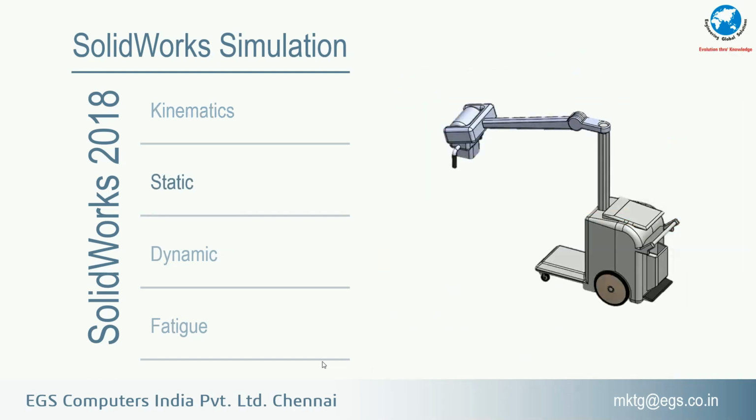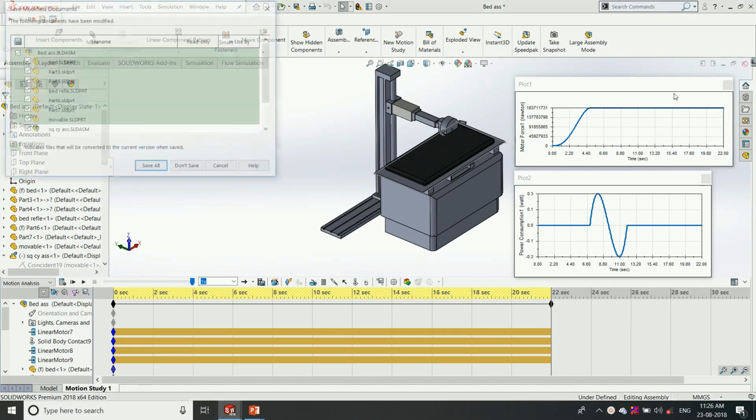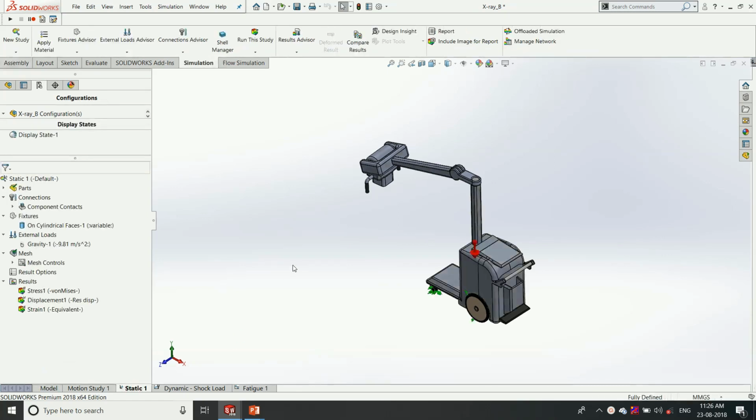Now we are going to study the static analysis. In static analysis we are going to study what the stress level or the stress distribution in the area is for the given load, so that we can find whether it will satisfy the working conditions of a load process or not.